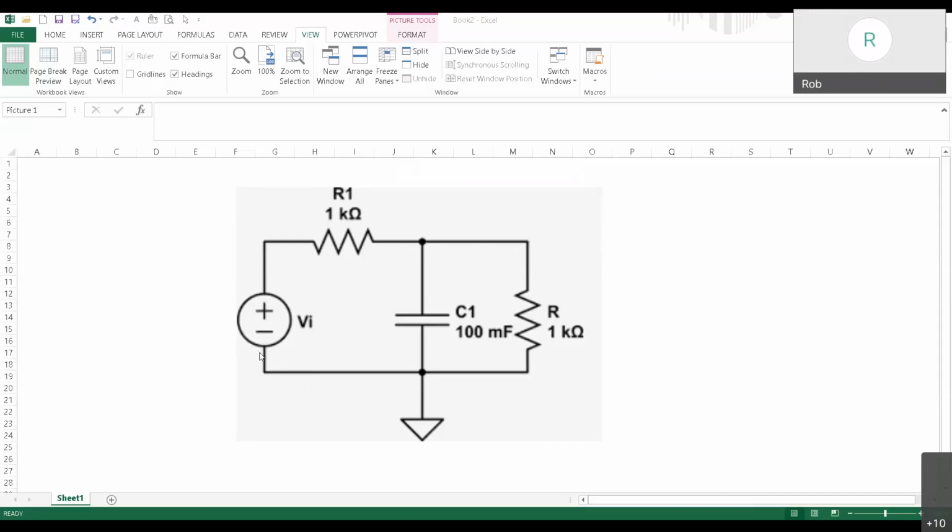So what happens is when you switch on, you get flow through here. This fills up, and when it fills up, the flow stops, but then it continues here continuously. For as long as the inspiratory time is going, you get a continuous flow of current through here, or in this case, flow from the ventilator. And that's why you have a constant flow. This pathway gets shut down as soon as the lungs fill up, but this pathway goes continuously, and that's why you have virtually a continuous flow. At the beginning, you have flow in both of these pathways.